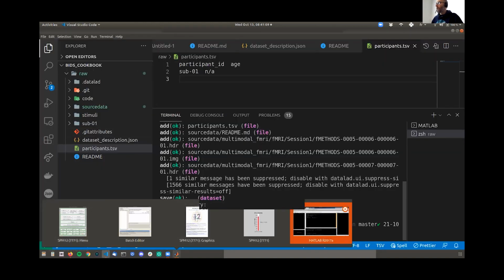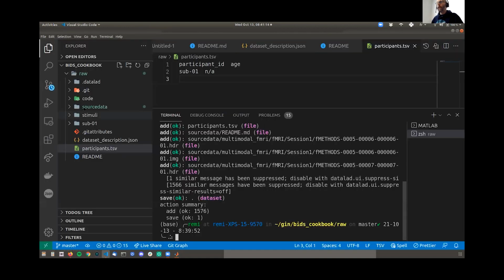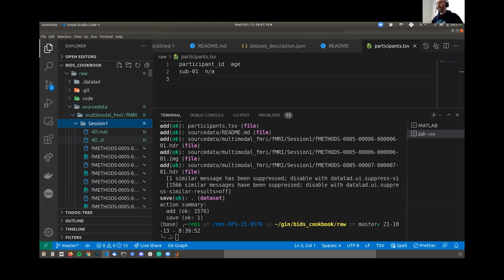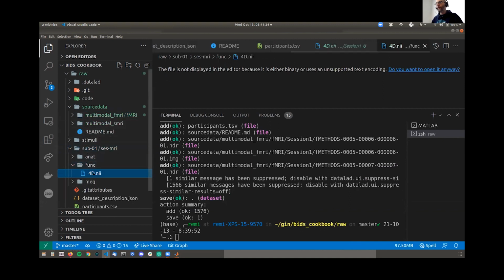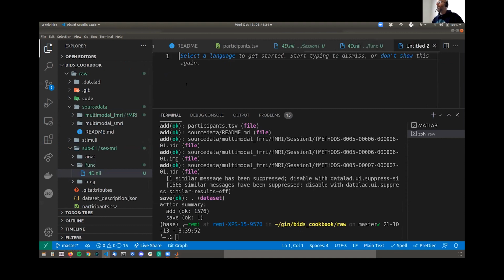Hopefully it shouldn't take too long. There, done. Then you grab that file and put it into your func folder, and you need to give it a name. So it's going to be sub-01, session MRI.